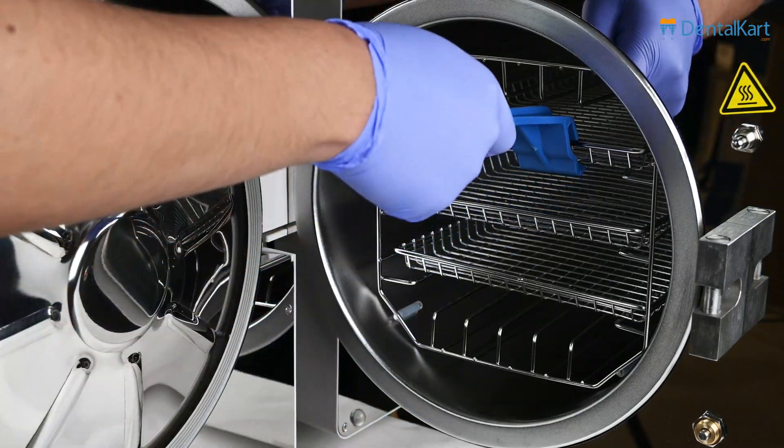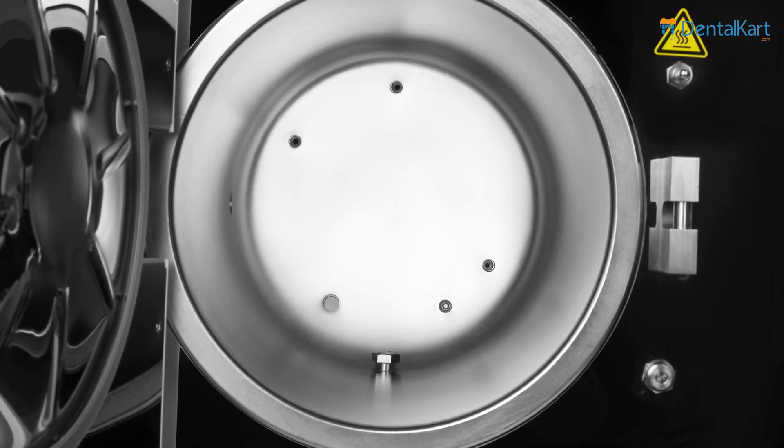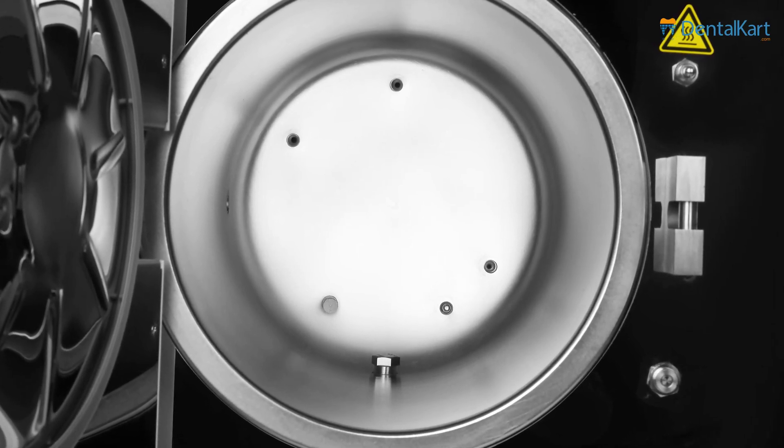There are trays and tray racks in the chamber. Inside the chamber, we can also observe temperature sensors and a drainage filter.